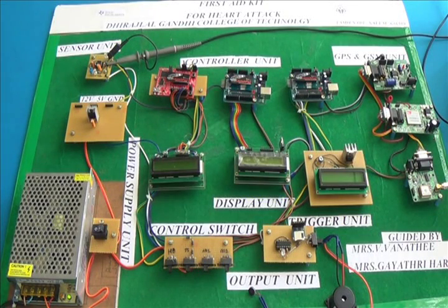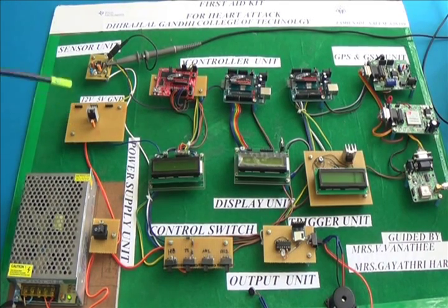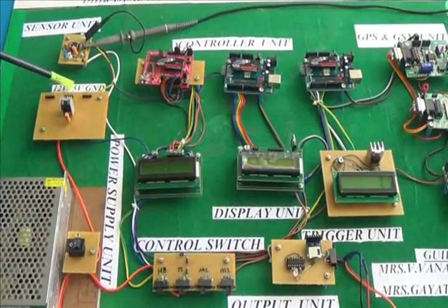In this kit we are using a power supply. This is a 12V 5A power supply. This is the overall power button, which is used to switch on the power supply. Here there is a regulator, which supplies 12V 5A power and ground.